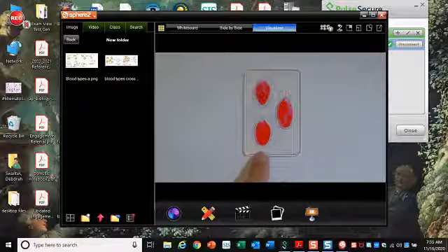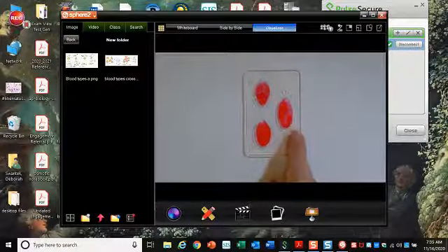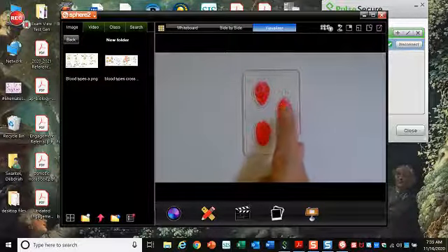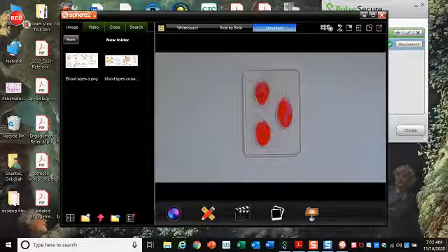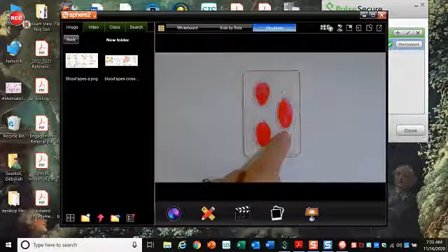I don't see any agglutination with my anti-B antibody, and with my anti-RH antibody, I see all these lumps. Okay, so that is my indication of agglutination. So sample 1's blood type is A positive.